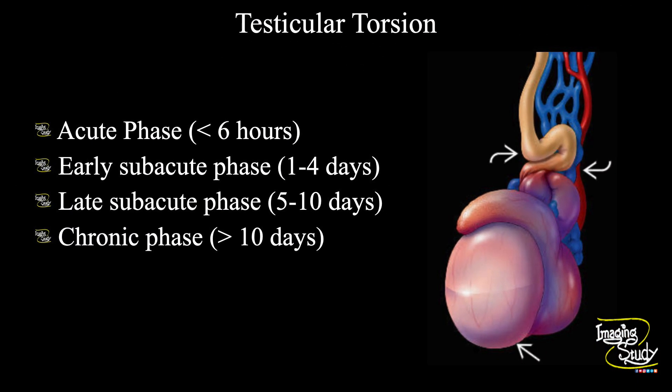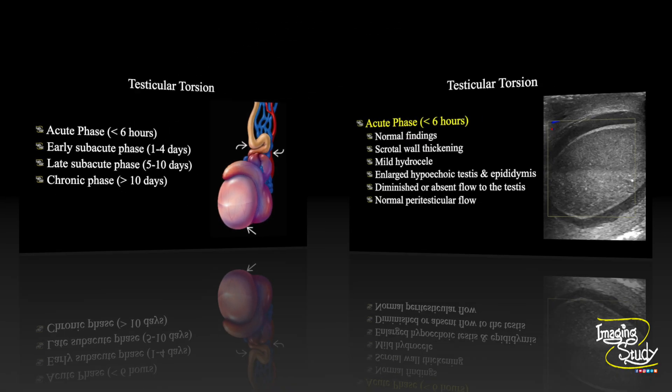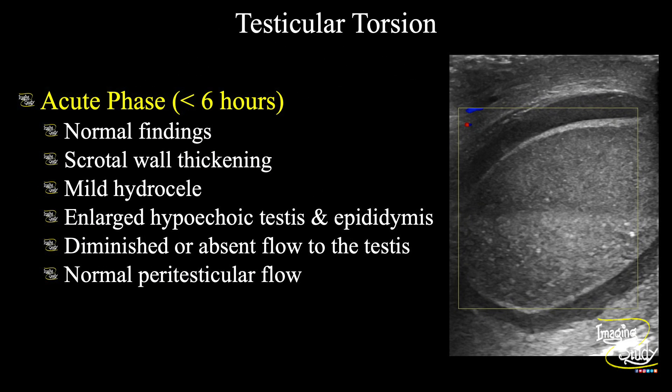We have four phases of testicular torsion. In the acute phase, the findings may be normal; you may see scrotal skin thickening and mild hydrocele. The testes and epididymis get enlarged and hypoechoic. On color Doppler, there won't be any intratesticular flow but normal peritesticular vascularity.